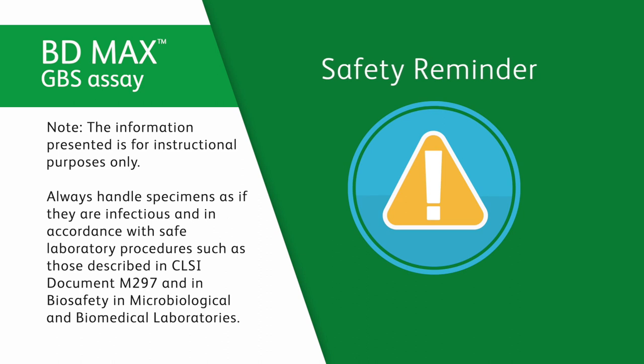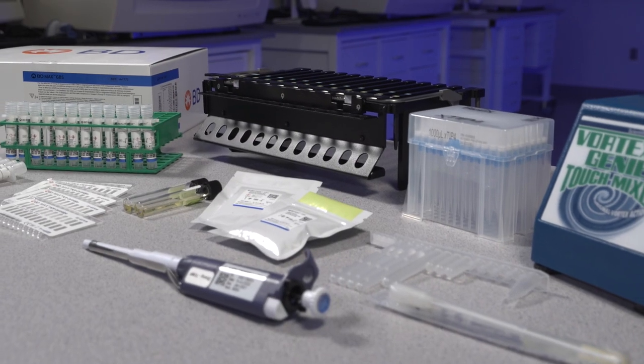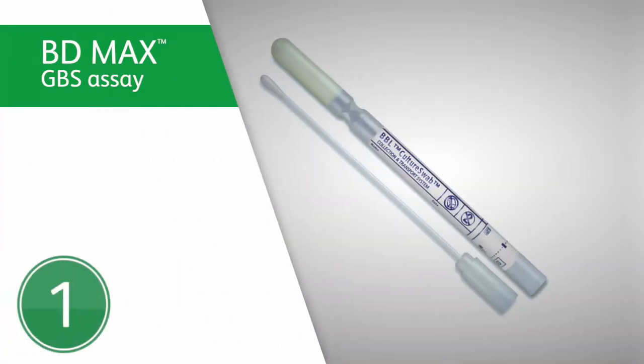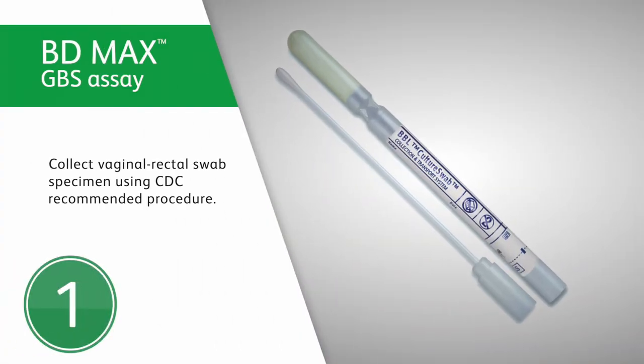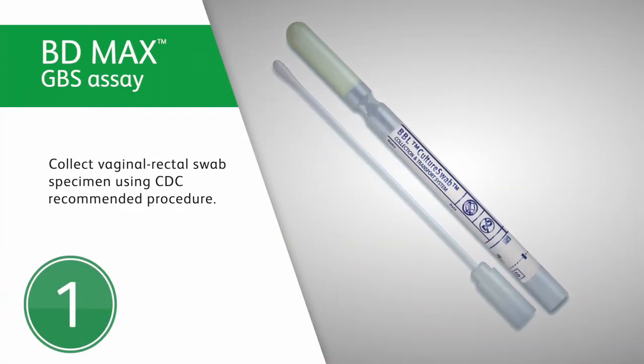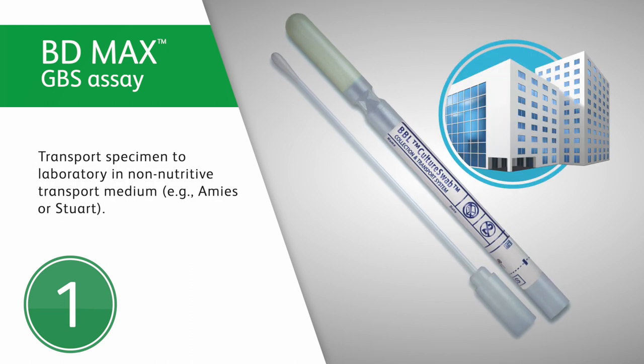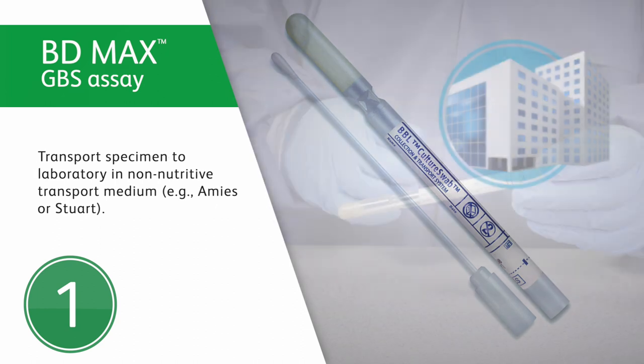We will cover how to collect, transport, and prepare specimens for testing using the BD-MAX GBS assay. First, collect the vaginal or rectal swab specimen using the CDC-recommended clinical procedure. Transport the specimen to the lab in a non-nutritive transport medium, for example, Amies or Stuart.